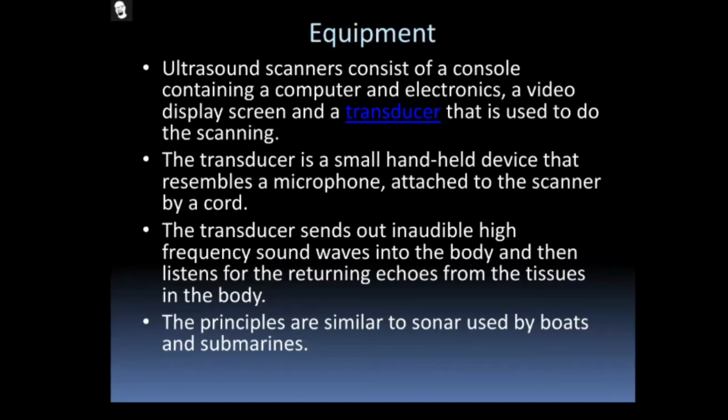Please remember, I will read out the point again in simple English so you can understand clearly. The transducer sends out inaudible high frequency sound waves into the body and then listens for the returning echoes from the tissues in the body. That is a very important thing. The principle is similar to sonar used by boats and submarines. We can send the signal into the liquid medium and we can also receive the signal. That principle is applied over here.